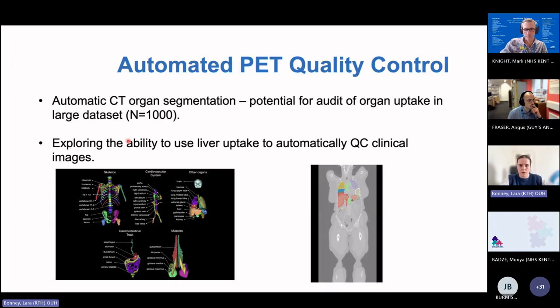So actually my doctorate work looks at sarcoma, in which you can have very, very large abdominal tumours. And I was very surprised at how well these segmentation approaches worked, even in patient cases where the tumours significantly distorted the position and the location of the organs.